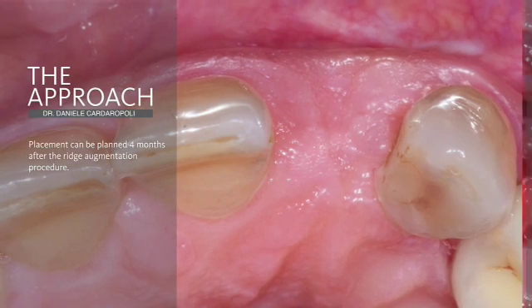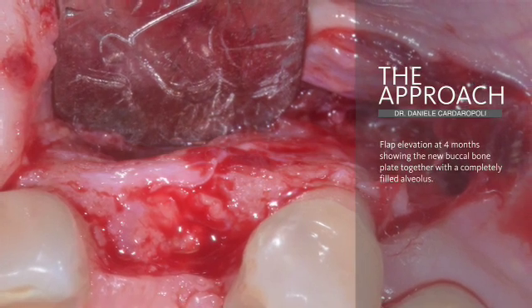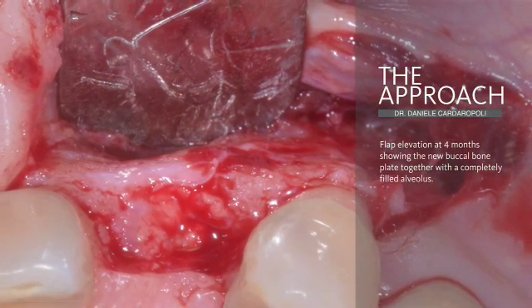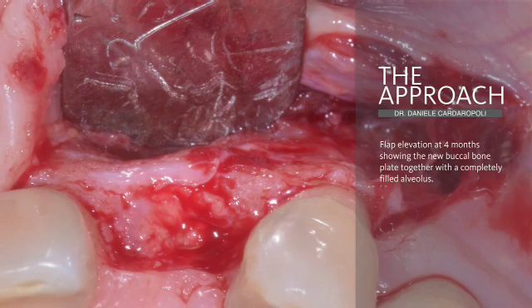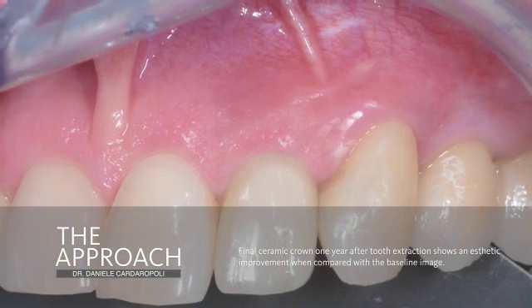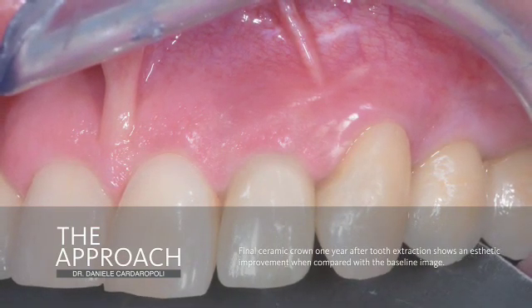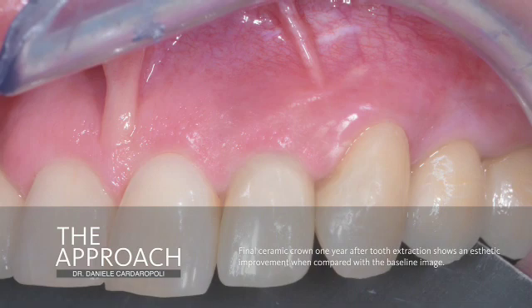After four months, at the time of reopening, we can see a complete bone filling of the previous socket with the reestablishment of the buccal bone plate. This leads to the insertion of a prosthetically guided implant with a final ceramic crown that shows an aesthetic improvement when compared to the baseline.